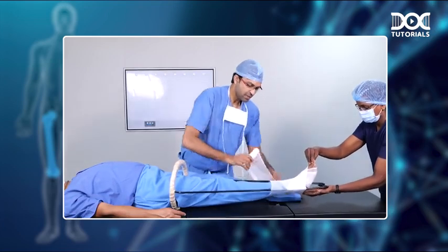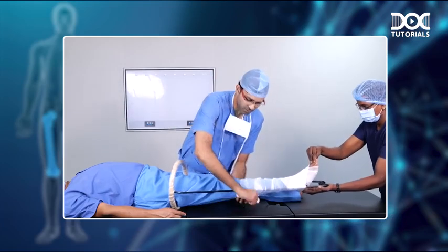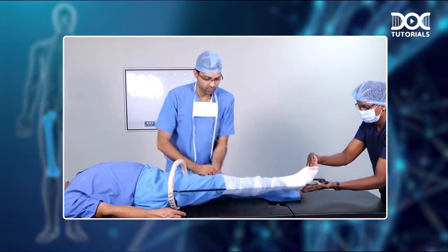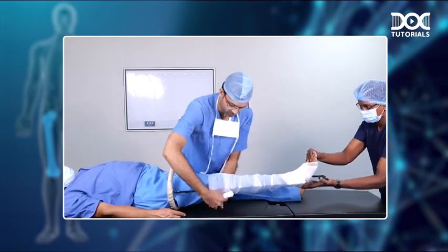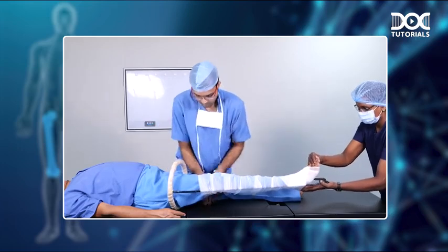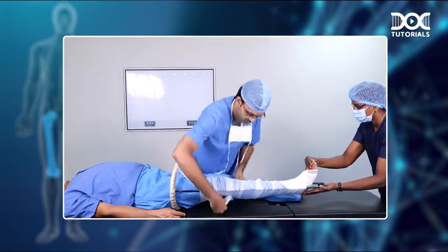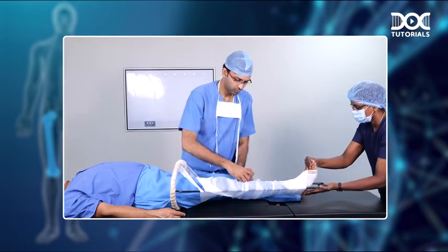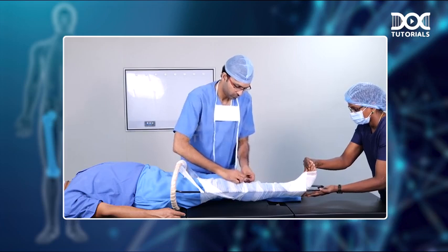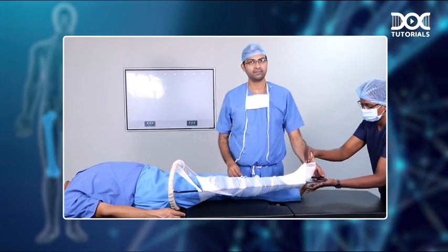So make sure you nicely put bandages all around the leg and the femur to stabilize the femur. So this is how you apply the Thomas splint.